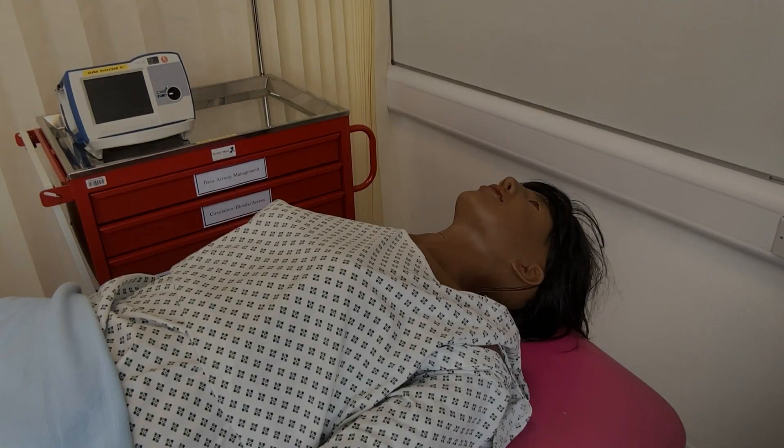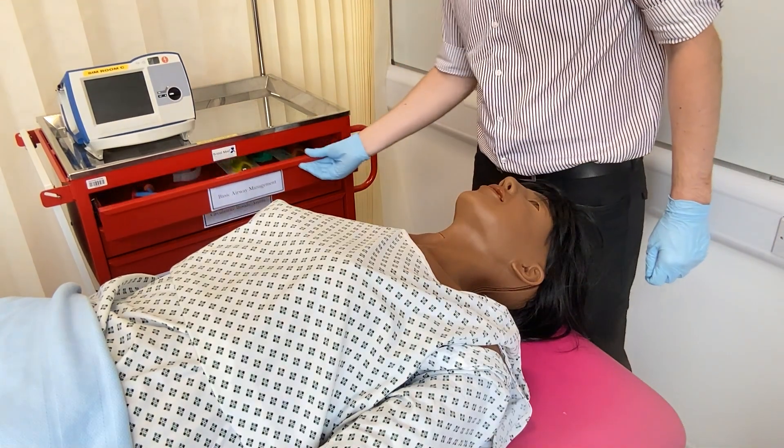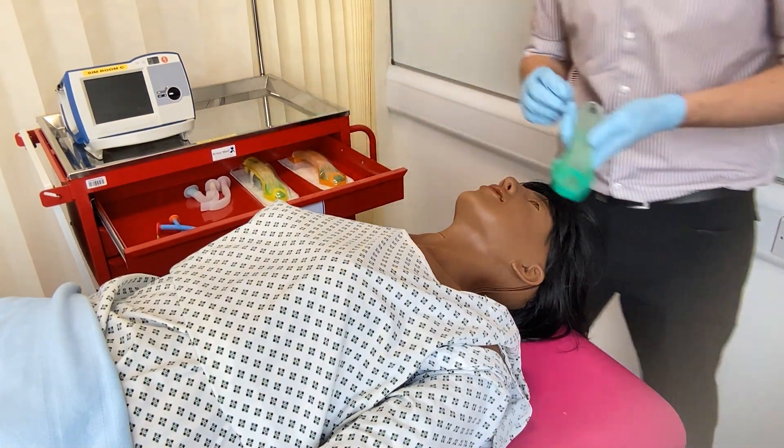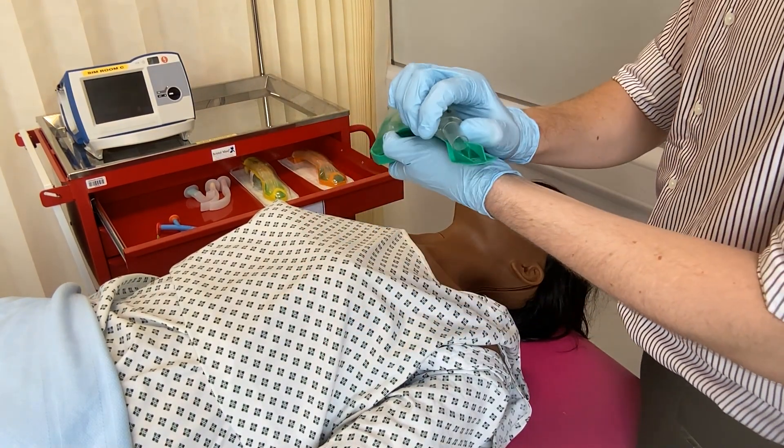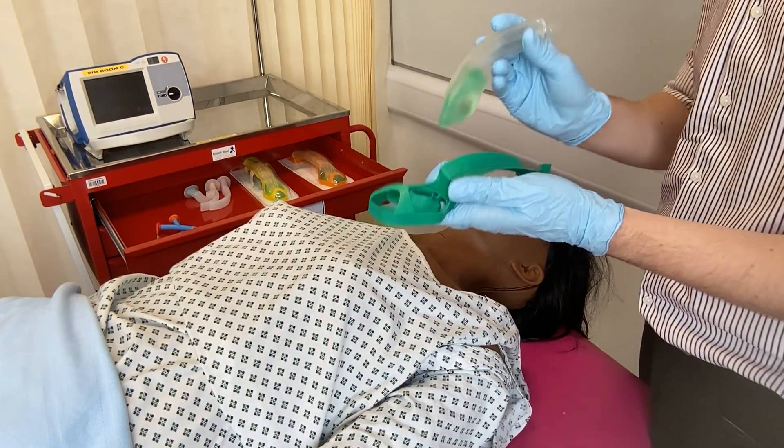Moving on to discuss i-gels. An i-gel is a type of supraglottic airway commonly used in the UK. There are several sizes, with each having its own recommended weight category by the manufacturer. The size 4, which is green, is for patients 50 to 90 kilos.